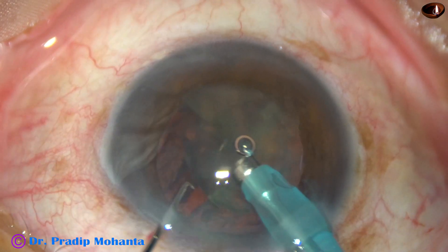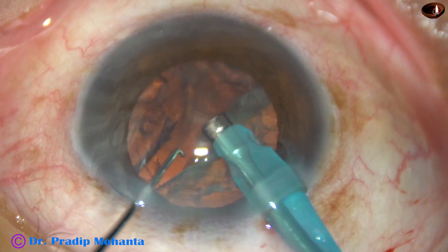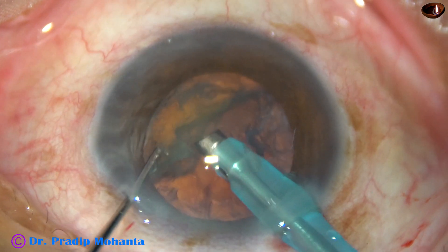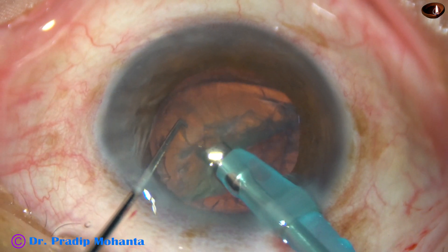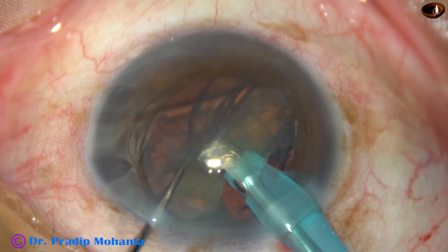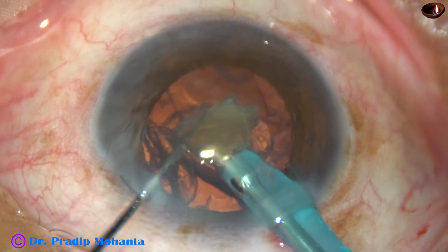Each fragment is emulsified and engulfed. Now let us see this other hemi-nucleus. It is rotated. The tip is engaged with just very little vacuum — almost no vacuum — and it is divided and removed.